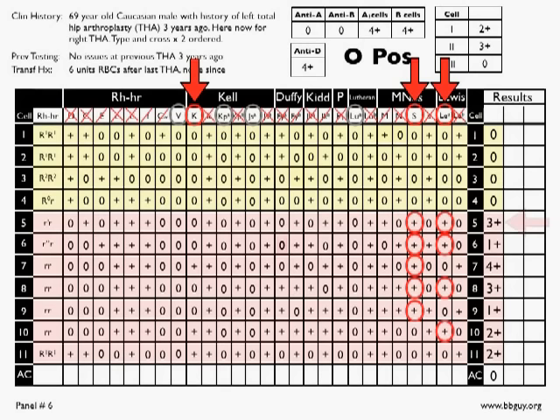Let's just go cell by cell and see if these make sense. Okay, so we have double dose of both big S and Lewis A in cell 5. That might work with a 3+. You have a single dose of big S and a double dose of Lewis A in 6 with a 1+.